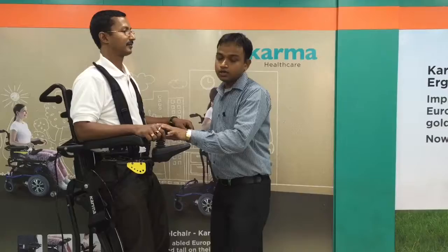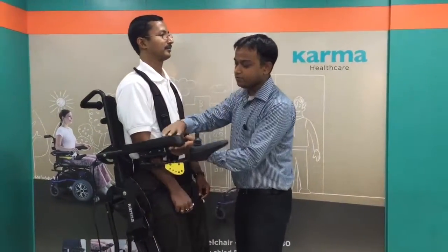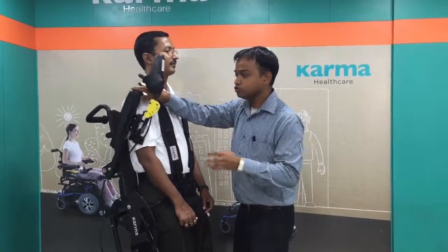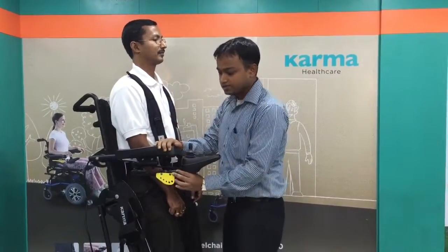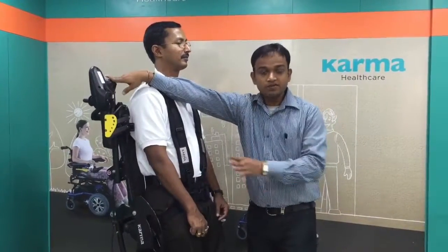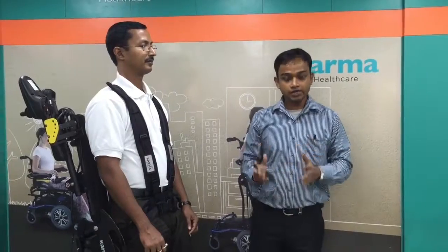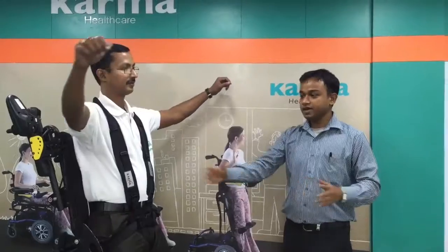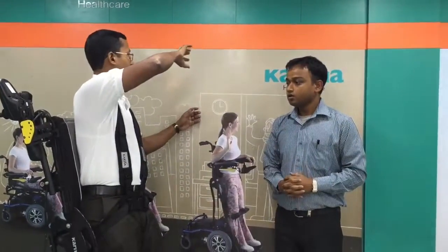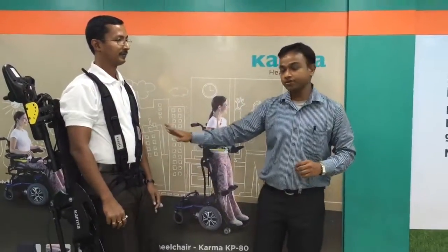The KP80 comes with flip-back armrests — both the left and right armrests can be flipped back. The joystick is also a swing-away joystick. Due to that, you can explore more space in front of you, where you can stretch your arm to a bookshelf or reach nearby spaces that other wheelchairs can't easily access. You can see there is no obstruction between his two arms.